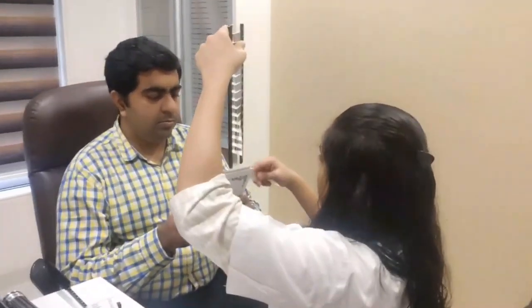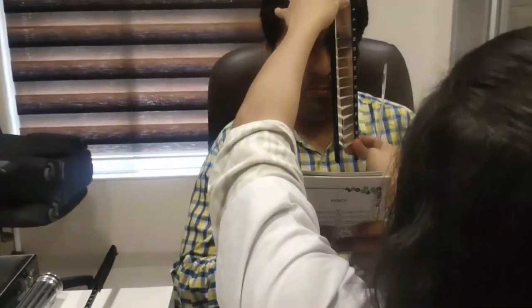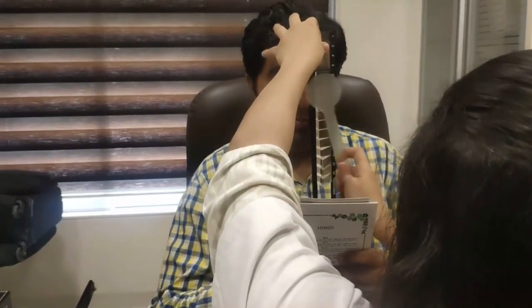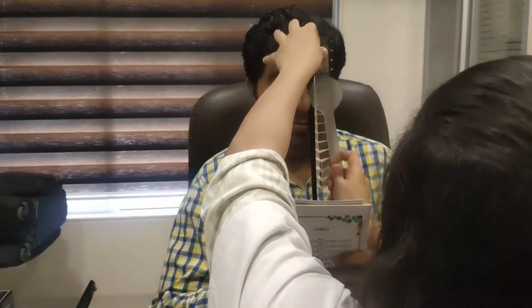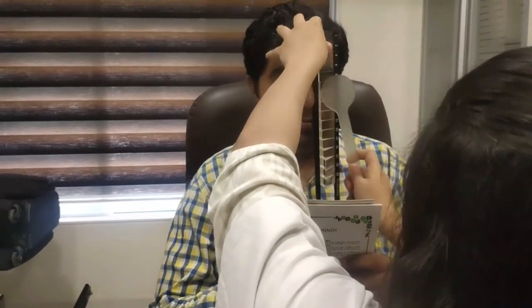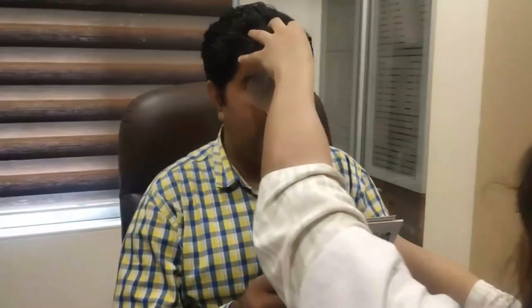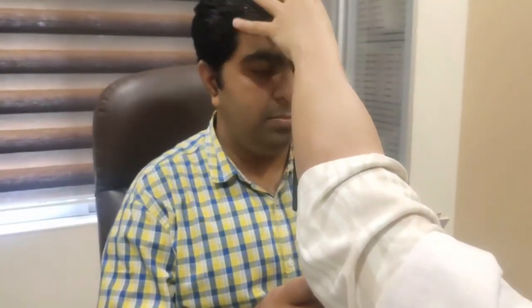On doing a prism cover test for near, with apex towards the deviation placed in front of the left eye, we can see that with 10 prism diopters base in, the movement of the eyes is stabilized. There is no movement of any eye outwards on covering it or inwards on uncovering it.